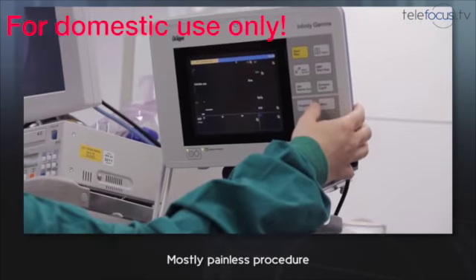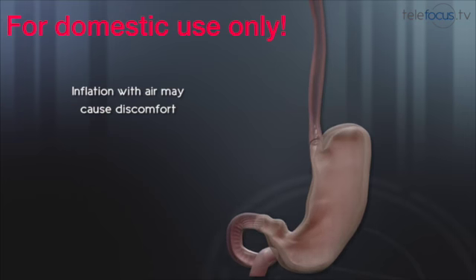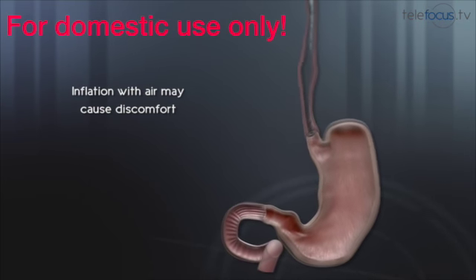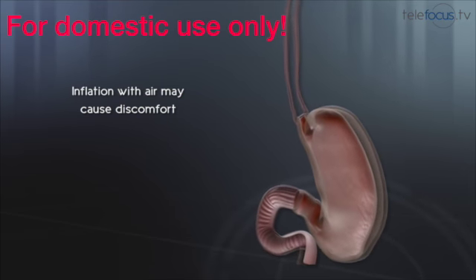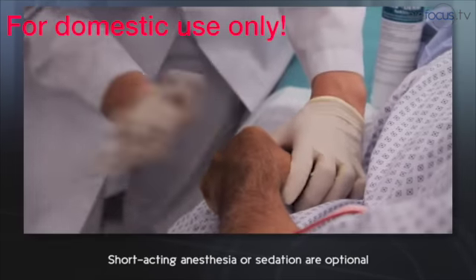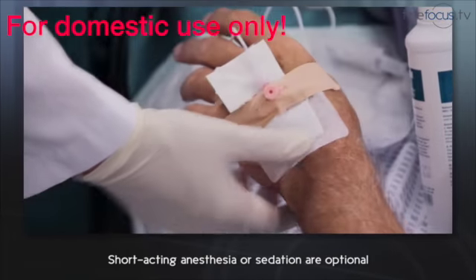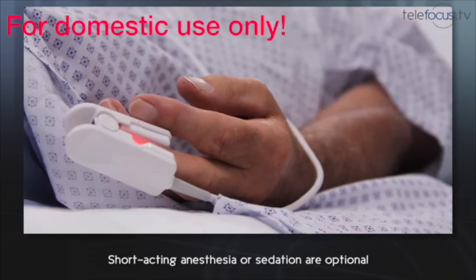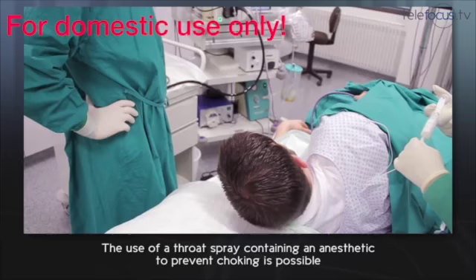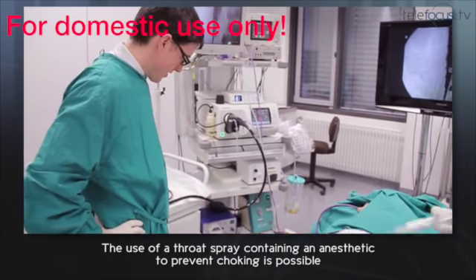The procedure takes only a few minutes and is to a large degree painless. To unfold the organs, air is inflated. This procedure and the actual intervention can cause discomfort. If you wish, you may receive an injection for anesthesia or mild sedation, so you can oversleep the intervention. The endoscopist may numb the back of your throat by spraying on some local anesthetic and prevent choking.